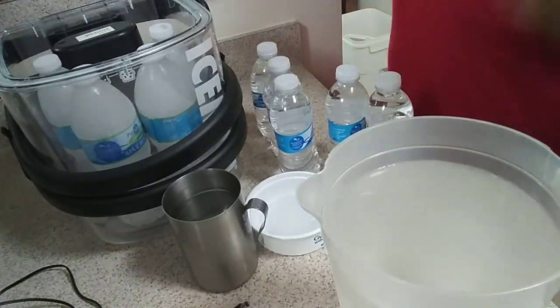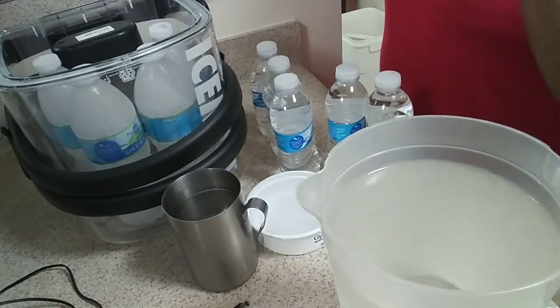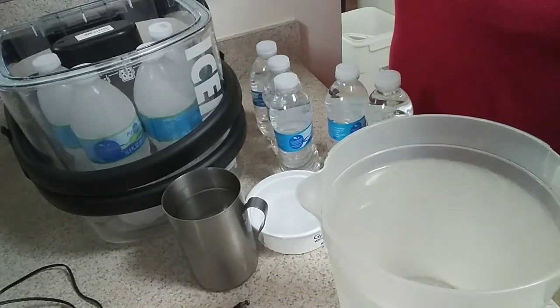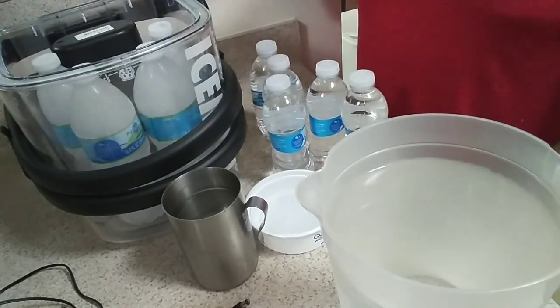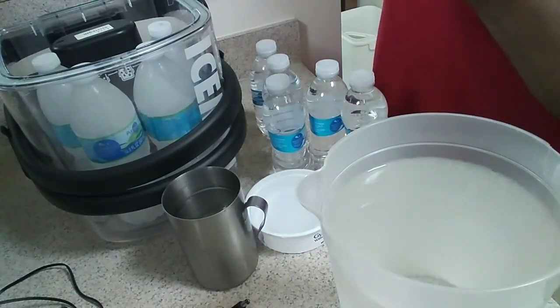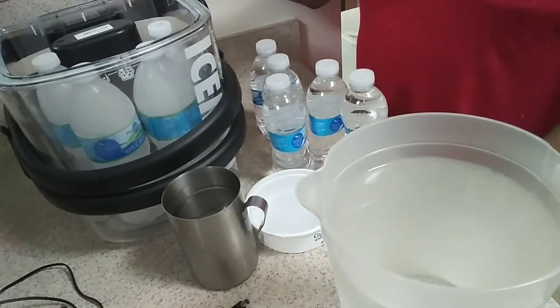Now, my son said that it doesn't get ice cold — it's cold, but not the type of cold he was looking for. He said even with the ice cubes it didn't get real, real cold, but it is cold. So I think it's just not something that gives you that extreme cold when you pour refrigerator water into it. But as long as you're getting that cold therapy — and when he first had his surgery, this machine would run at least six times a day — the main thing was to keep down the swelling, and that's what this machine does.